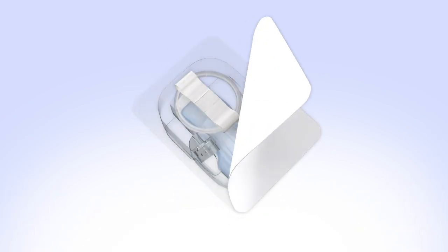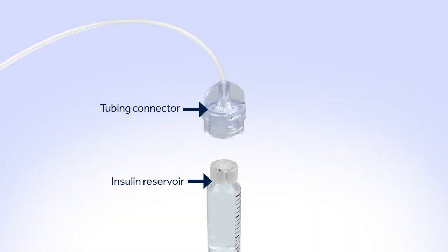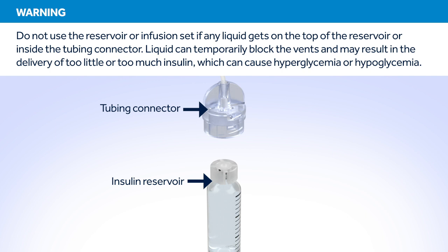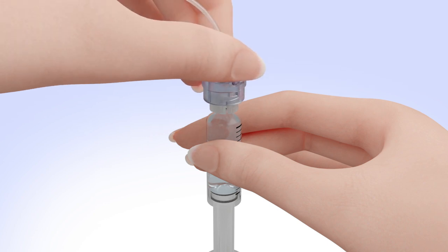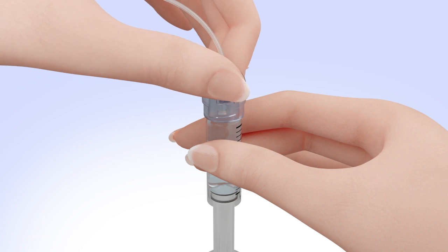Remove the infusion set from the package. Make sure both the top of the reservoir and the inside of the tubing connector are dry before connecting them. Liquid can temporarily block the vents on the tubing connector. If any liquid has gotten on the top of the reservoir or inside the connector, start over again with a new reservoir and set. Hold the tubing by the connector and place it on the top of the reservoir. Find the right position by turning and gently pushing the tubing connector until you feel it slides smoothly in place. Turn the tubing connector clockwise until the reservoir and tubing connector lock with a click. The tubing connector should not be loose or come apart from the reservoir.